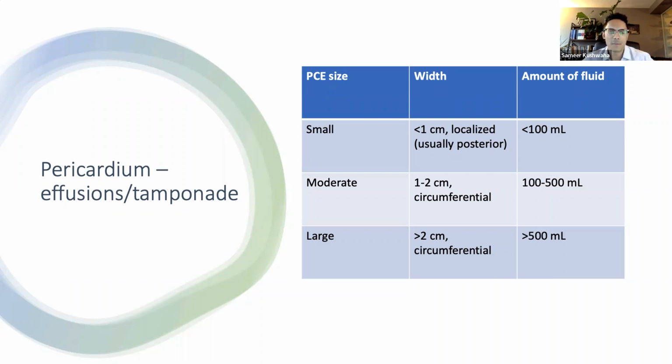And just to mention that when we're actually measuring the pericardial effusions, we do so at the end of diastole when the effusion looks its smallest.